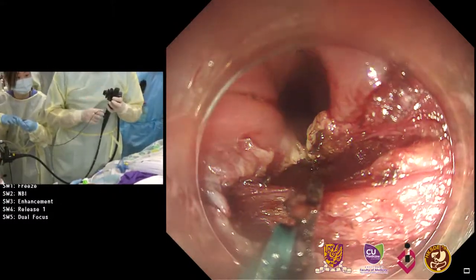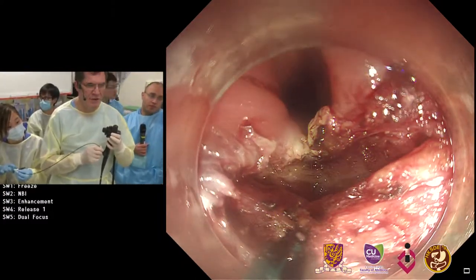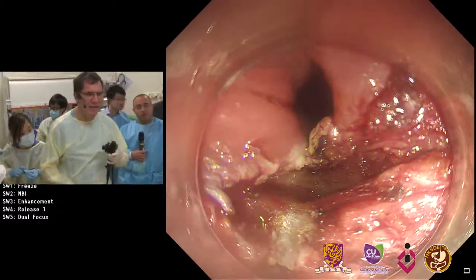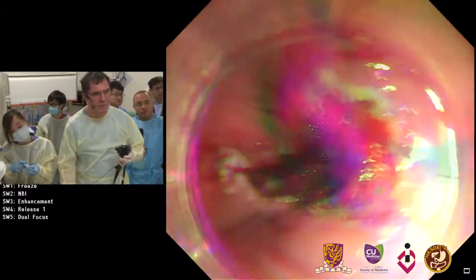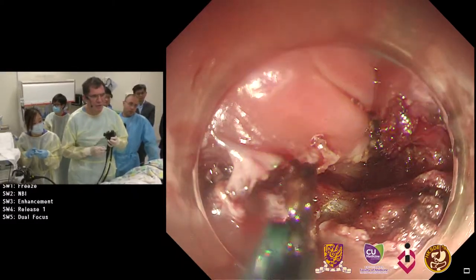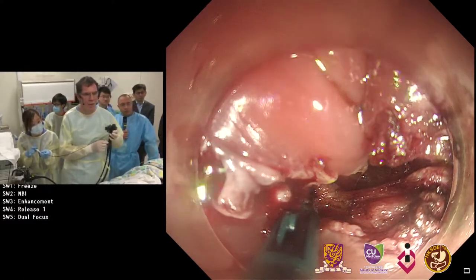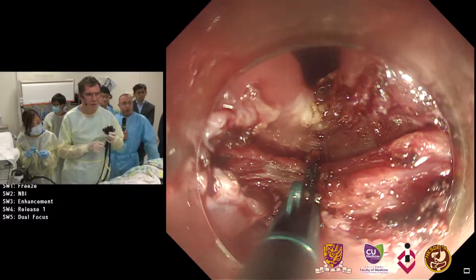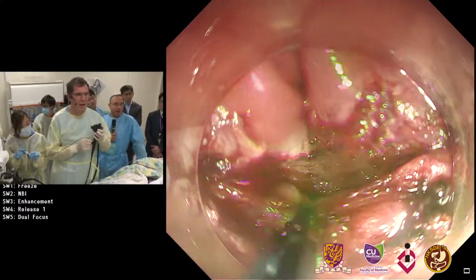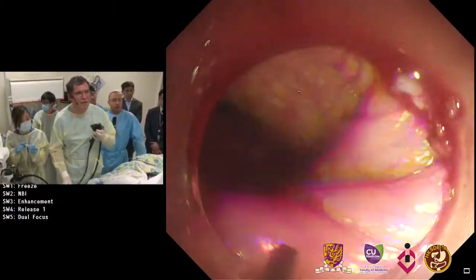What are your landmarks when you know you've cut enough? In this situation we still have five centimeters to cut. I'm not sure whether I will cut the whole septum — at the end we'll definitely need some clips because there are sometimes minor bleedings. When we get to the bottom of the diverticulum, we have to check whether we can cut more or if we're done. But we have a way to go, so that's not an issue right now. Still a long way.